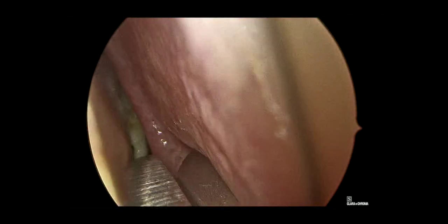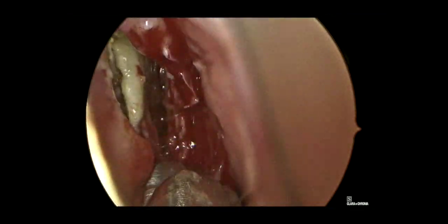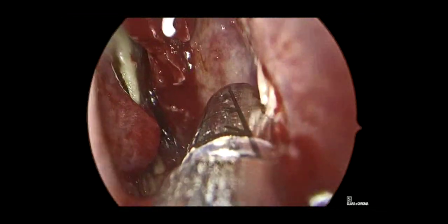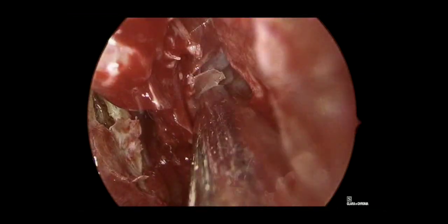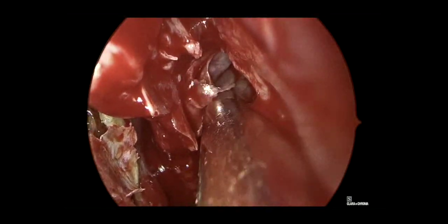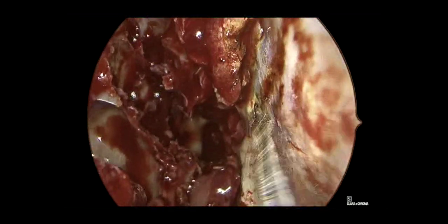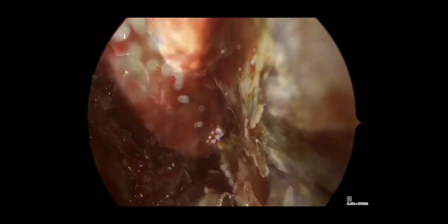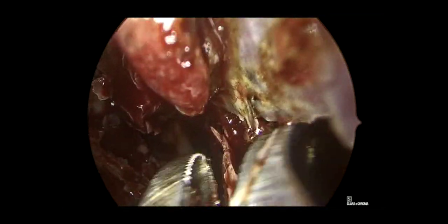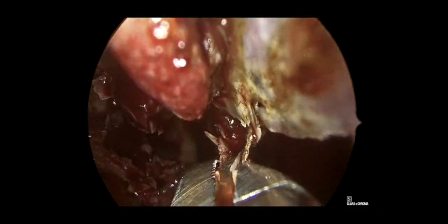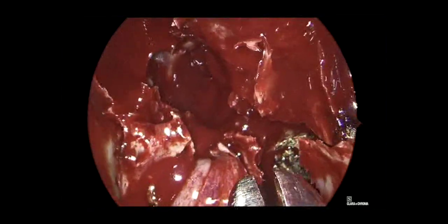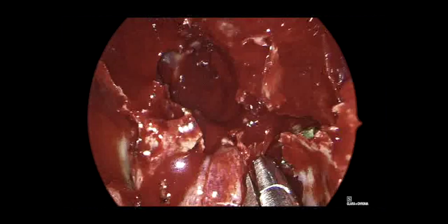For the cranial base resection, we'll remove the left middle turbinate as well. This was involved with tumor, but it fairly well respected the middle turbinate and did not extend far laterally into the ethmoid region. Completing a left-sided maxillary antrostomy and total ethmoidectomy, with normal-looking healthy mucosa visible. Now here we are working on the septum itself to complete a near-complete posterior septectomy, taking out the bone and cartilage down to the floor of the nose to gain access for our cranial base resection. When possible, we'll leave the anterior septum for support of the nose. The last bit of the keel of the rostrum is being removed.